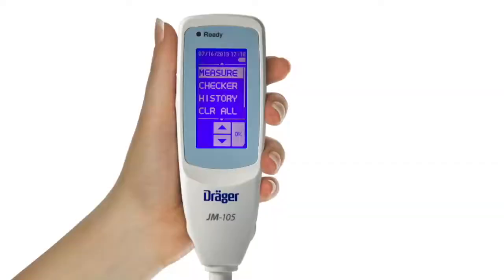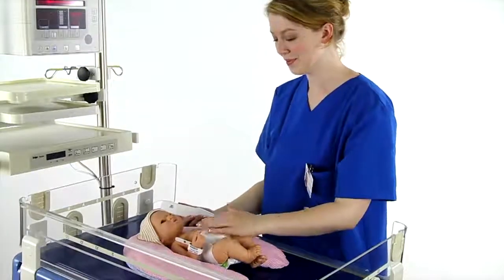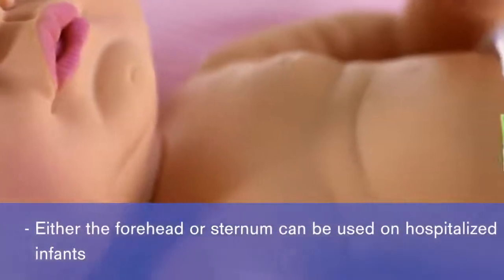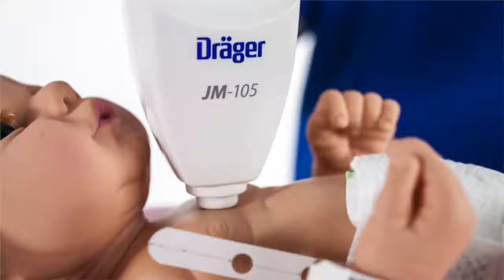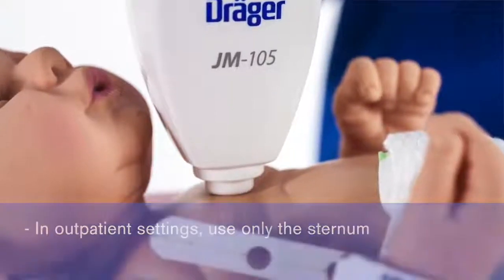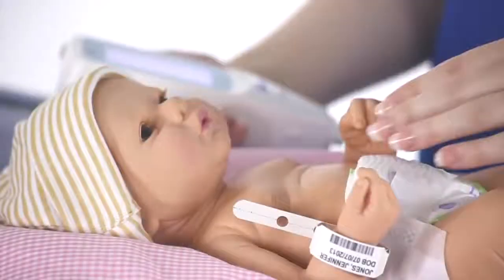From the main display, select Measure. To take a reading, first make sure the infant is calm, because movement can interfere with accurate measurement. Choose a measurement site on the baby's body, either the forehead or the sternum. If you are using the JM105 in an outpatient setting, such as a clinic or physician's office, use the JM105 only on infants younger than 14 days of age, and use only the sternum as the testing site. Avoid selecting bruised, excessively hairy, or discolored areas of the skin as measurement sites.